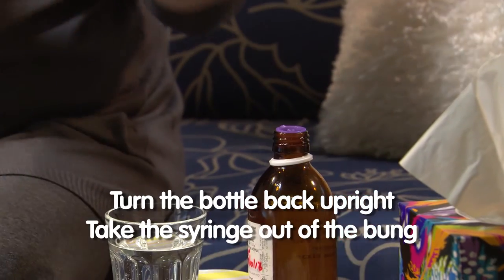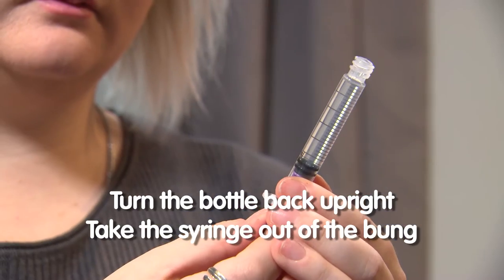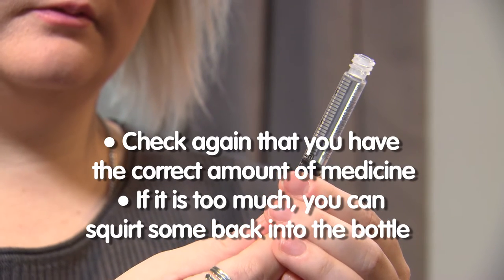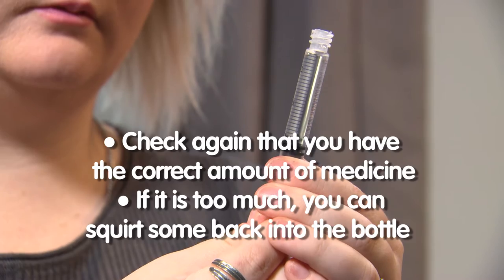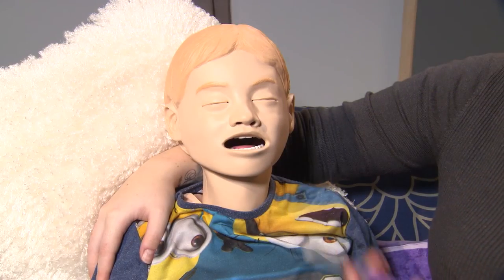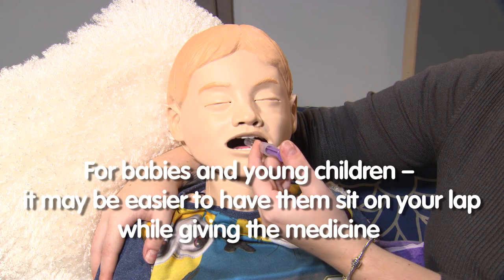Turn the bottle back up the other way, then take the syringe out of the bung. You need to check again that you have the correct amount of medicine. If it is too much you can squirt some back into the bottle. Once you are sure you have the correct amount of the medicine you can give it to your child.